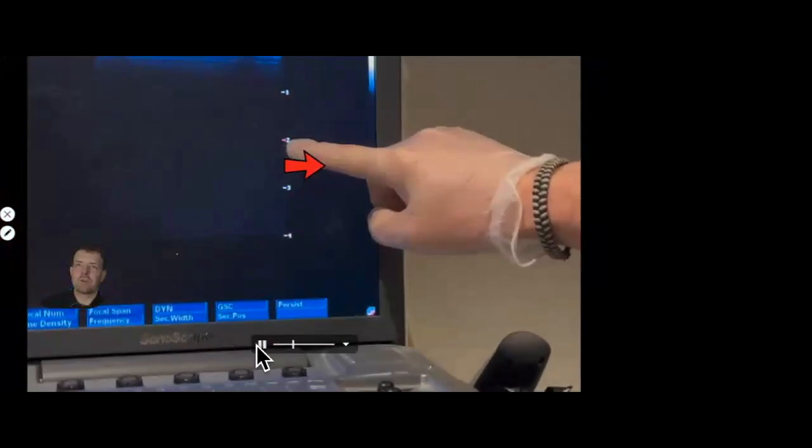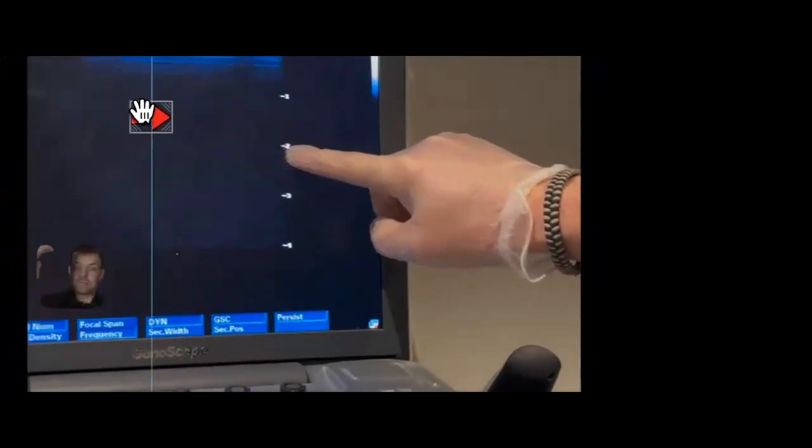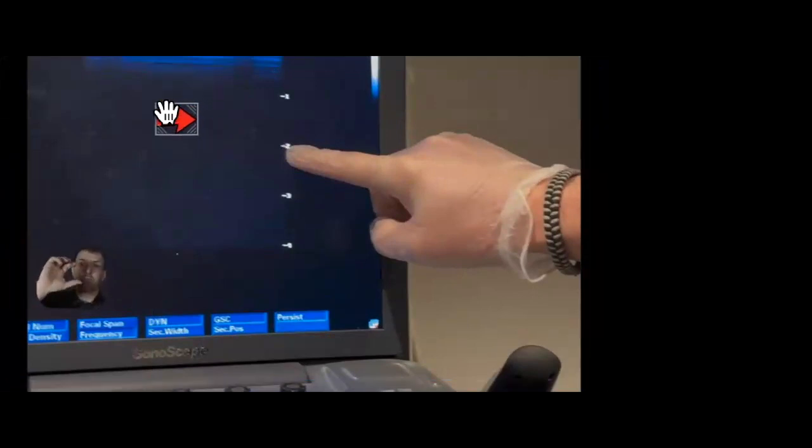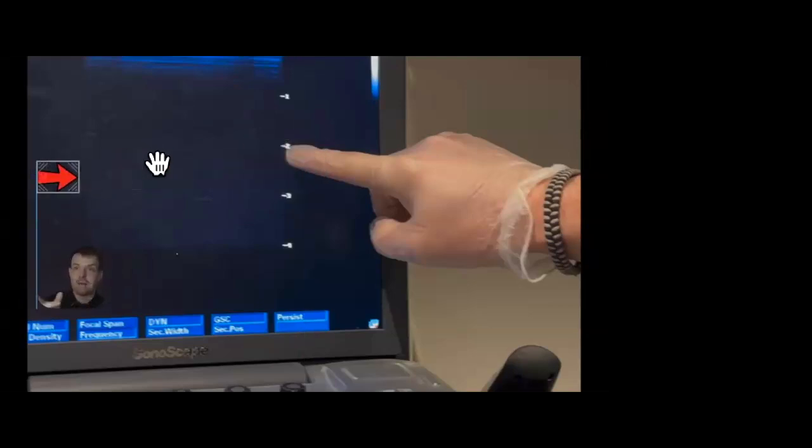So if you have got, I'll just pause that there. Let's say you're scanning, again, we'll use the Achilles as an example. So let's say we want to have a look at kind of around the fat pad. Okay, so we want to have a look at the Achilles fat pad, and you want the machine to focus on that specific level. So you get your depth sorted, so down to around about 3 centimeters, and then you change your focus to focus on that exact level where the fat pad is. And then all of the energy of the machine will focus on that specific depth. Okay, so you can really increase the quality of the image all along that focal line.